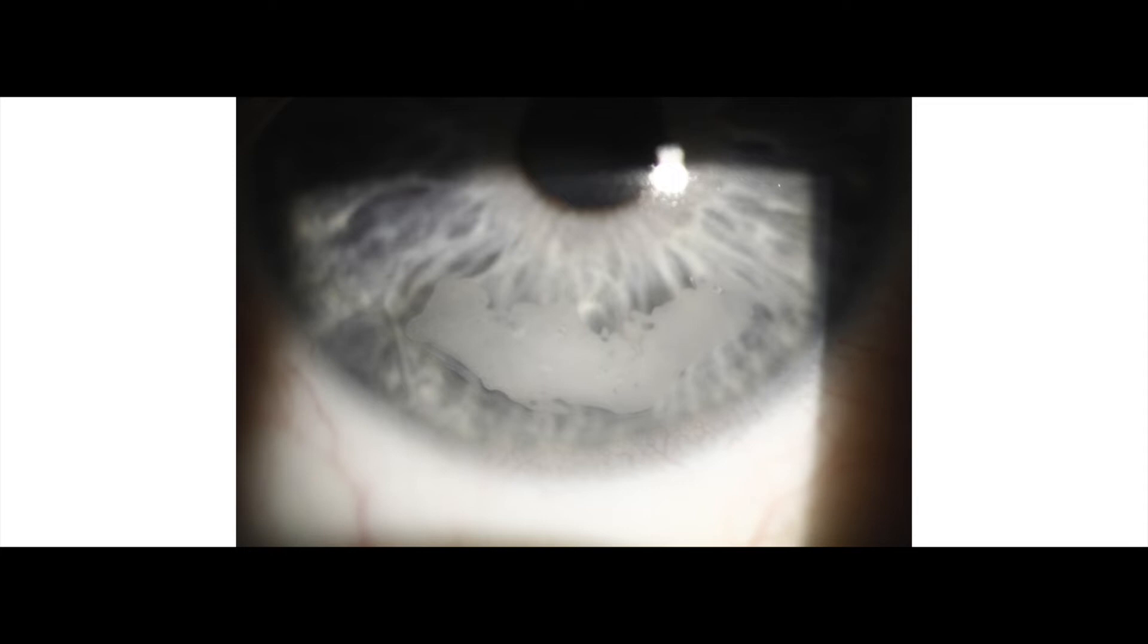Just apply multiple shots to the area of the epithelial ingrowth. You don't need to be aggressive. And the YAG is thought to aggravate macrophages that then eradicate the epithelial cells that are in the LASIK flap interface.